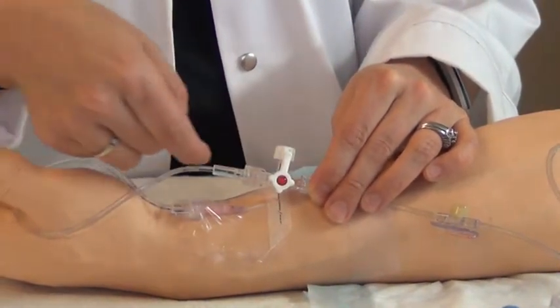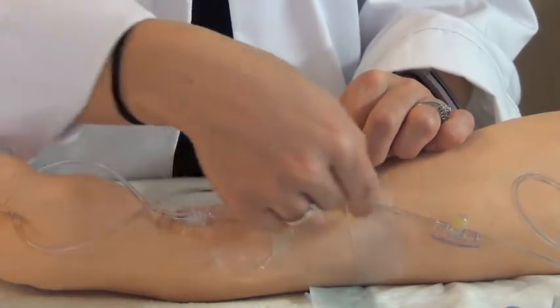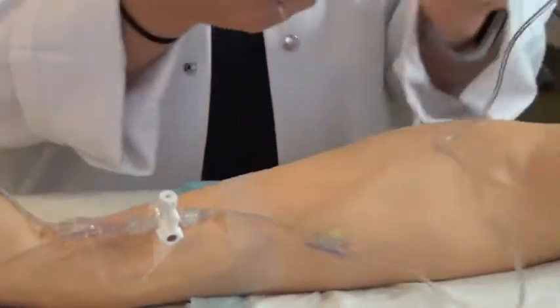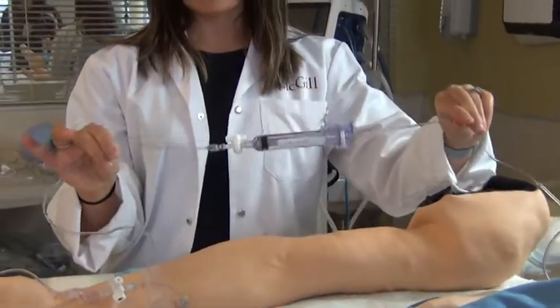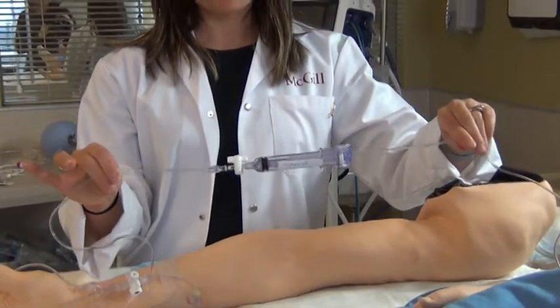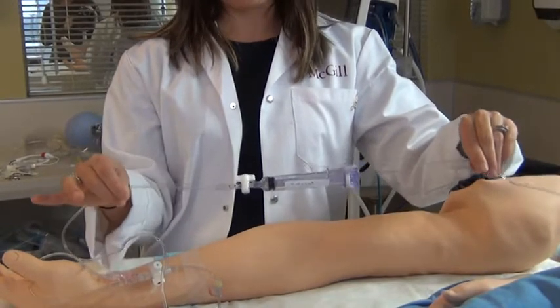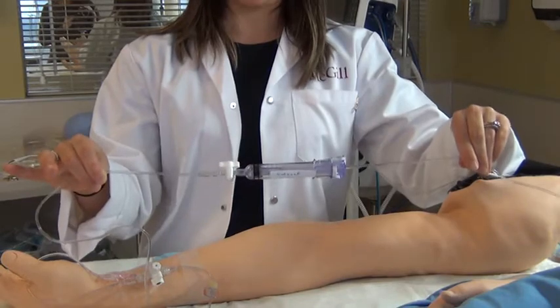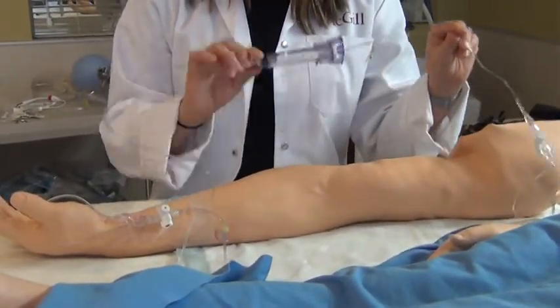So right now my line is open for the blood or fluid to flow this way. The other thing you will notice, as I was mentioning, is this syringe. This syringe is called a safe set, and this is something that is used in critical care settings in order to sample blood from a patient without losing the blood sample that you would normally throw out when you take a blood sample from a catheter. Okay, so we do not need to waste blood with this syringe.